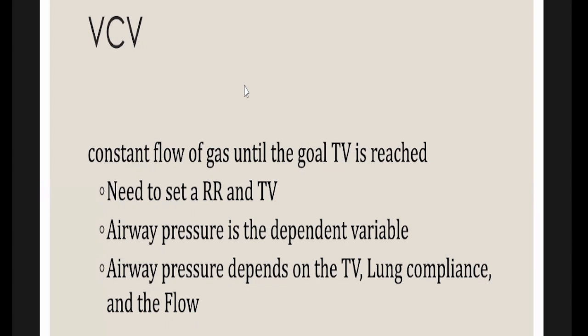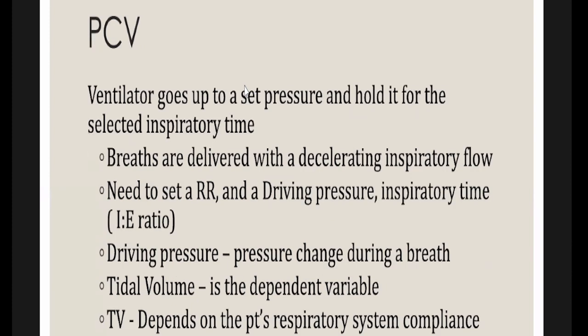Like I told you, there are two screens on the interface, two parts: the patient's part and the settings that we enter. All right, and we have pressure control ventilation similarly. So the ventilator goes up to a set pressure and holds it for a selected inspiratory time, and then the breath is delivered with a decelerating inspiratory flow. So you need to set a respiratory rate and a driving pressure.